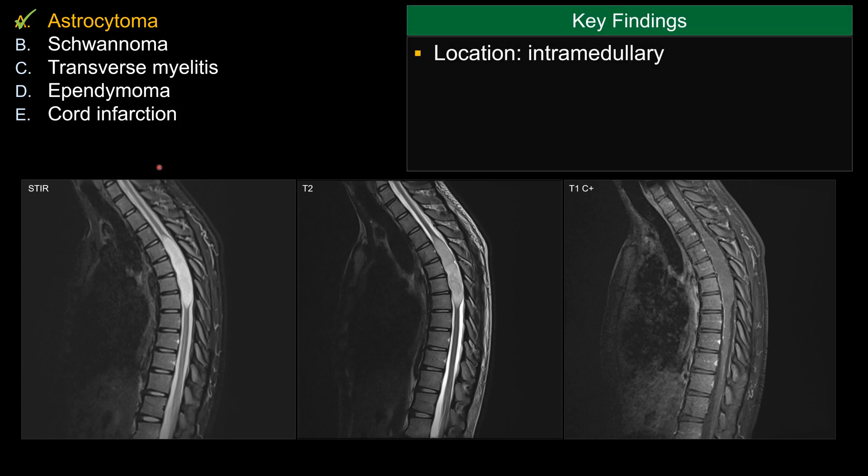When you see a spinal lesion, the first thing that you need to do is to localize which compartment this lesion fits in. This is an intramedullary lesion. Other lesions such as extramedullary intradural versus extradural have a different differential diagnosis.